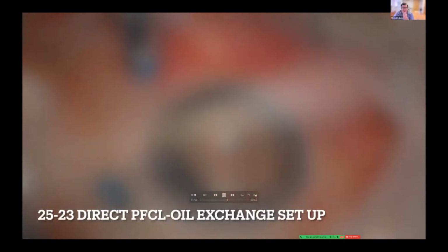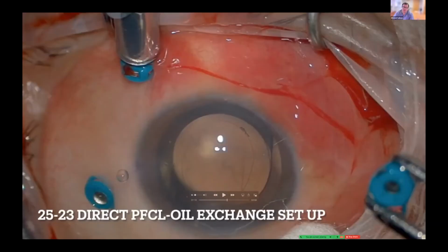So you have two options. One is to fill more and add laser with indentation. Or the other option, if you are going to go to air, then oil, then you can laser under air. It will be flat if the retina does not slip, or you can use cryo to that area, or you can complete that part under oil. But just be wary that the horns are an issue in giant retinal tear and retinectomy, and you really need to laser them well.